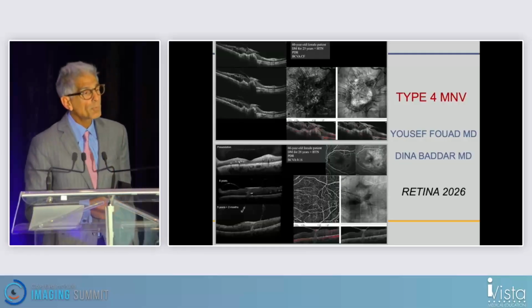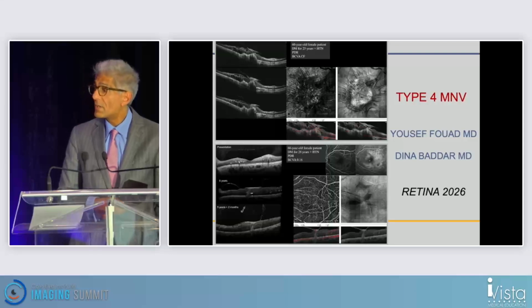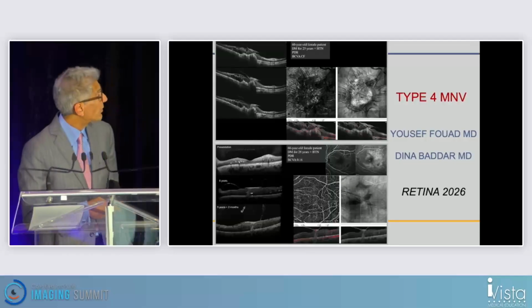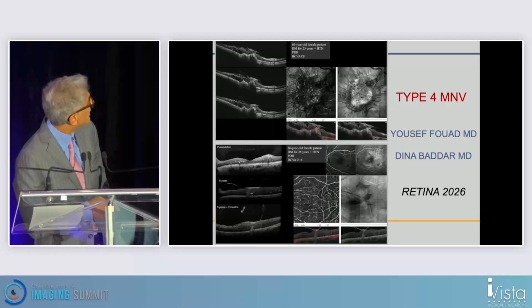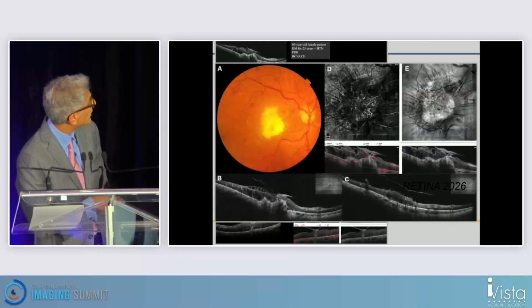So in patients with proliferative diabetes and severe non-proliferative diabetic retinopathy, several of them with hard exudates that can eventually lead to scars, we were able to identify these neovascular membranes with central posterior hyaloid fibrosis, and then this flow all the way up into the cortical hyaloid. And you can see beautiful examples of this. This was just published. It's in press.